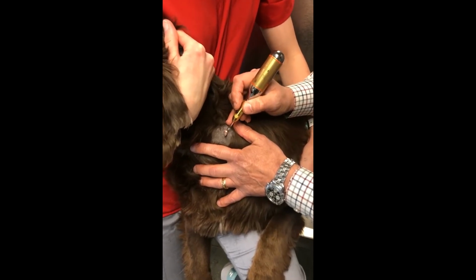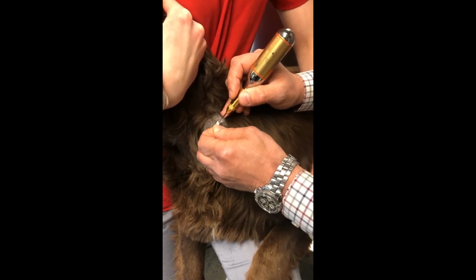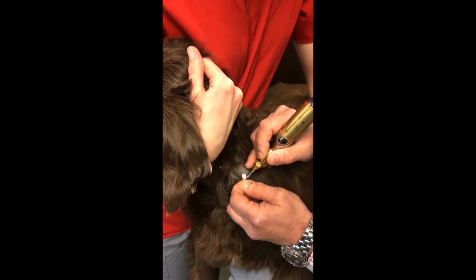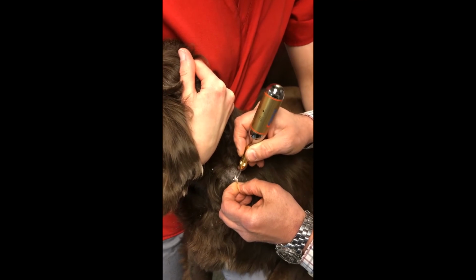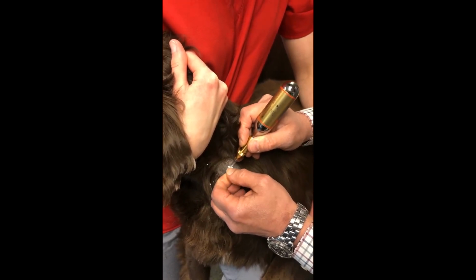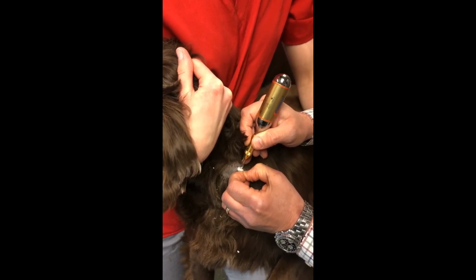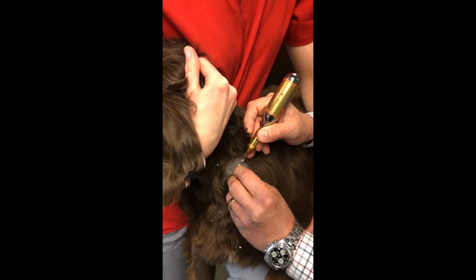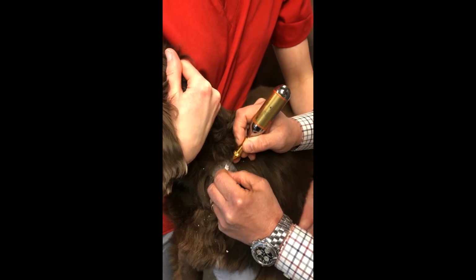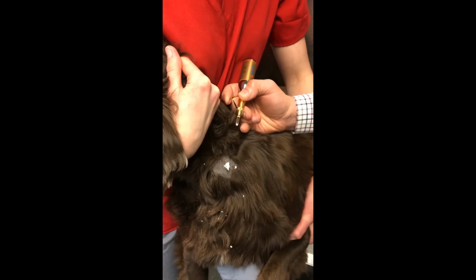So we're going to go ahead and freeze this mass from the base to the apex. We're going to freeze it over a period of about 45 seconds. We're going to do our best to remove any of the ice that is forming, so we get the application of cold directly on the tissue. Once the mass is completely frozen, we'll go through a thaw cycle.